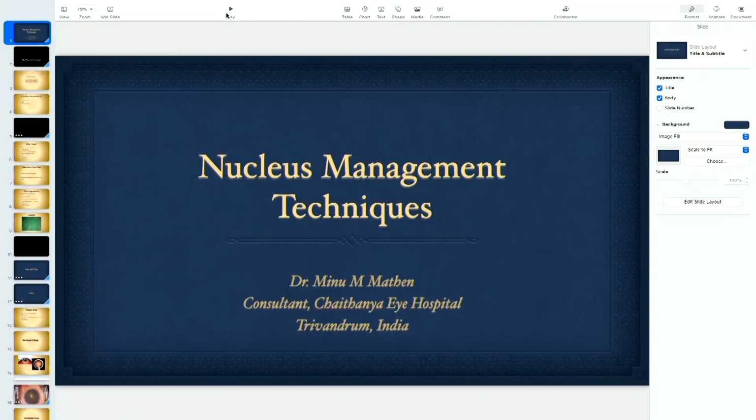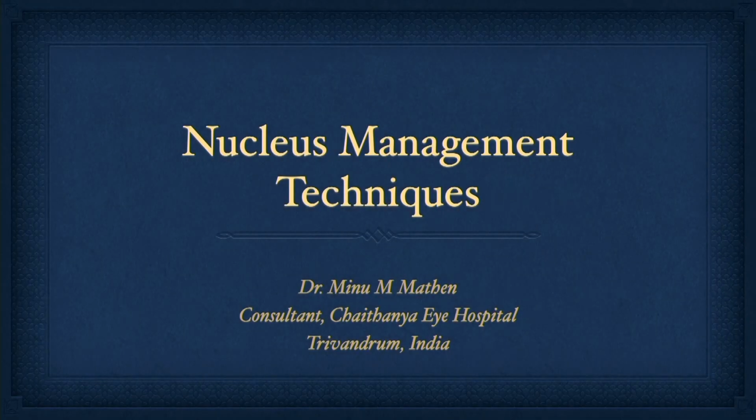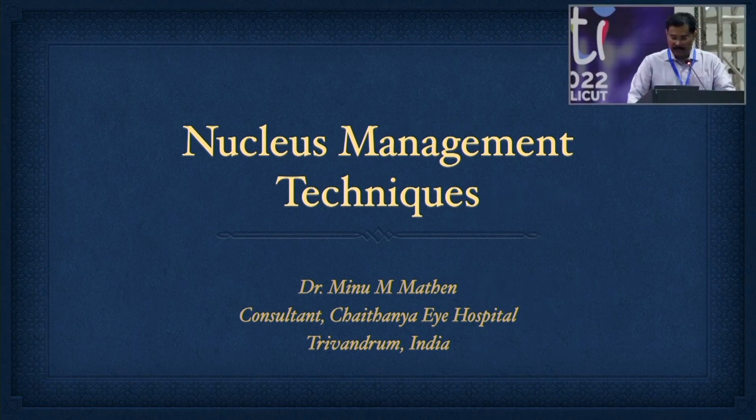So some nucleus management techniques have already been told. So maybe towards the end or when videos come, we'll talk about hydrodissection also, because without a hydro procedure, it's not a good idea to do phaco. So my basic topic was, the slides will go in this order, but then in between we'll talk about that also. Nucleus management techniques. So once you do a rhexis, we need to do a hydro procedure and then take out the nucleus. That is the main purpose.